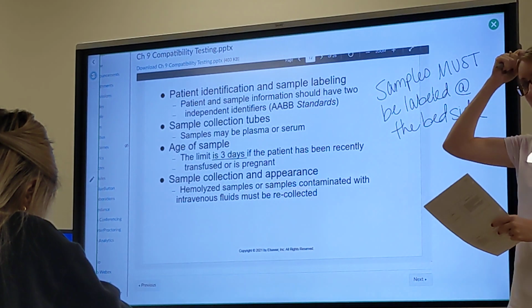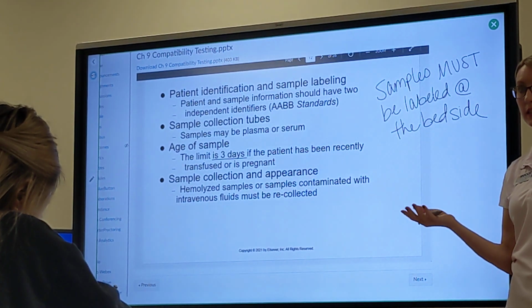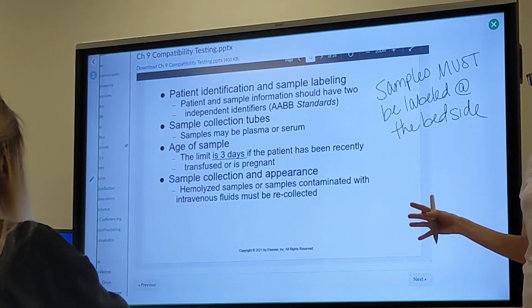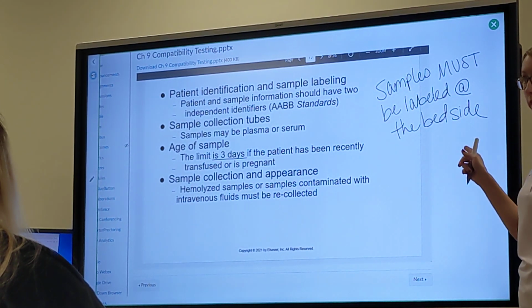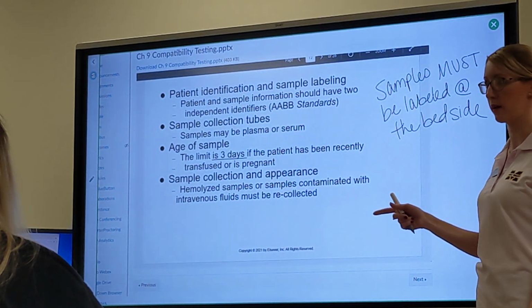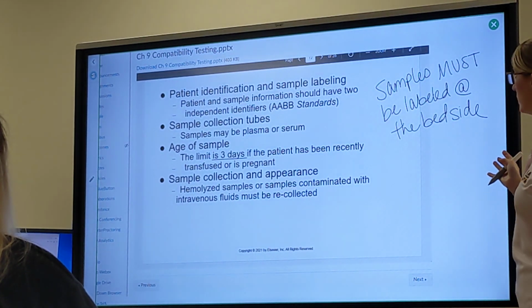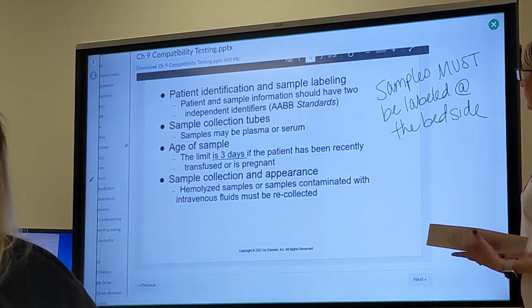I have caught new phlebotomists standing right outside the blood bank labeling their tubes. You can tell them right then. If you don't want to be confrontational, just stand on the other side of the window and wait for them to bring it to you, and then you cancel it and order another one. Just, no, you cannot use it. So if there are things going on in the background that you don't know about, then you'll never know. But if you see something bad happening, you have to stop it, because you're the one that's going to be doing the crossmatch. So this is another reason, because people do wild stuff because they just don't understand. A lot of us don't have the blood bank background that you're going to have. And so you just have to watch out for weird stuff.